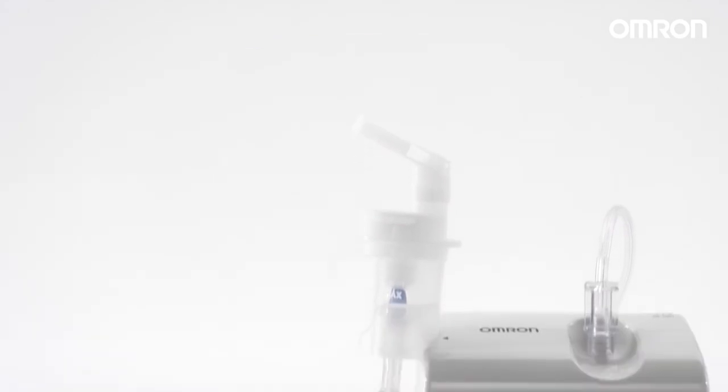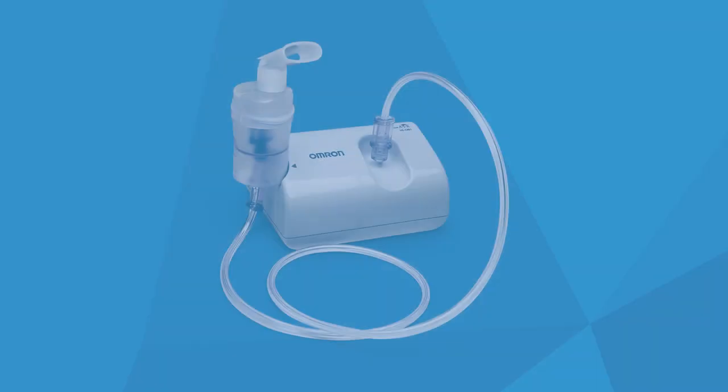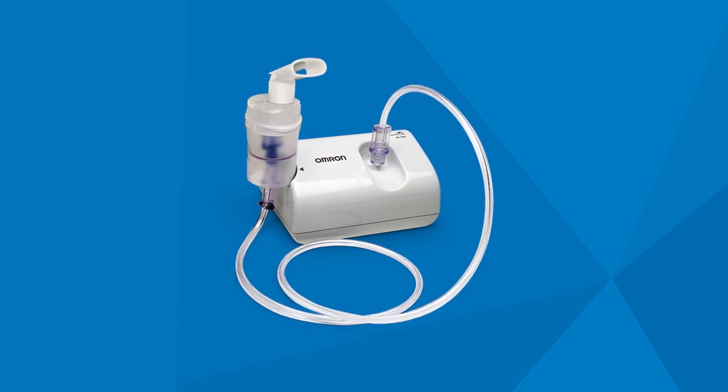Make sure that the air filter is changed regularly every 60 days. The Omron C801 nebulizer kit.